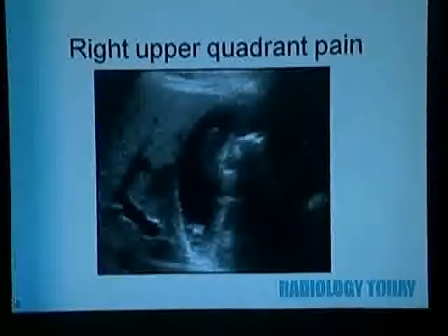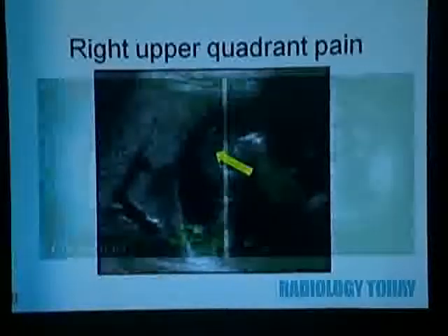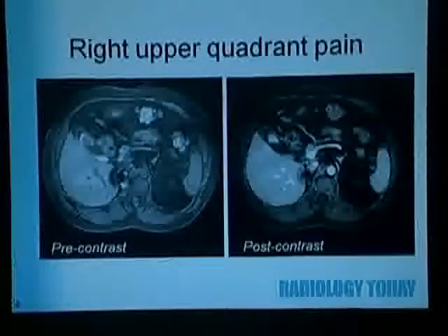The next case on a right upper quadrant ultrasound was this polypoid mass within the gallbladder. It was non-dependent. It was also non-shadowing. It doesn't look like a gallstone. The considerations at the time, could this represent a big polyp, perhaps some adherent sludge? It was at that time worked up further with MRI, which showed that it was enhancing.